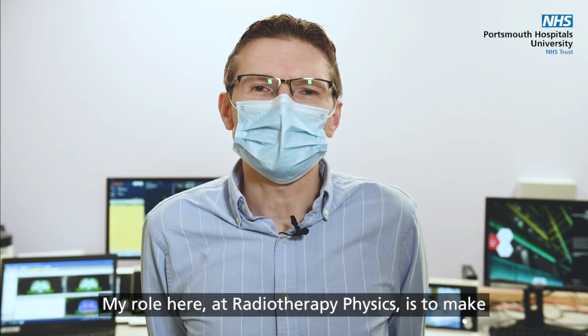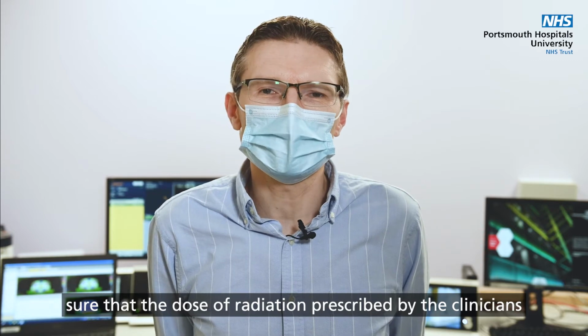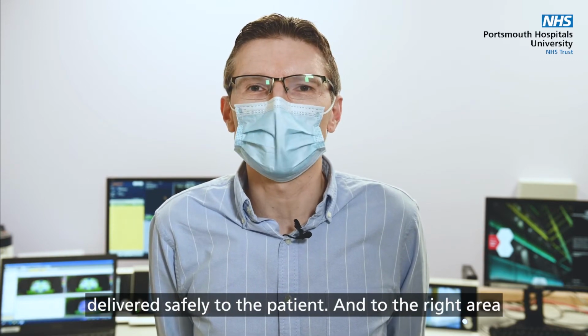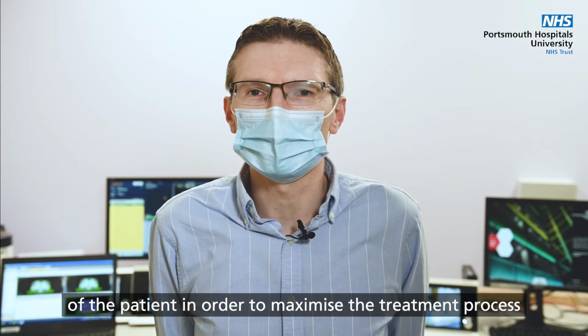My role here at Radiotherapy Physics is to make sure that the dose of radiation prescribed by the clinician is delivered safely to the patient and to the right area of the patient in order to maximise the treatment process and minimise any side effects to the patient.